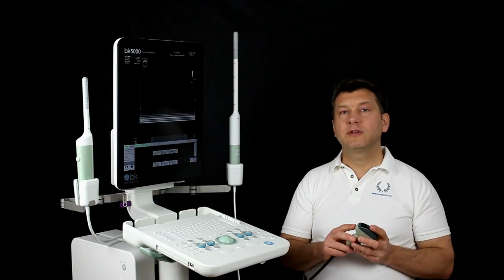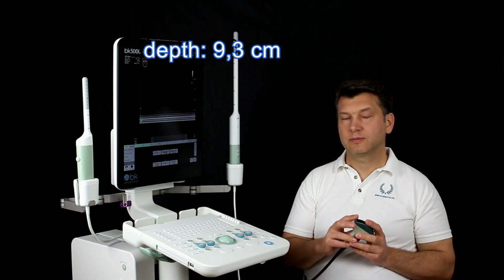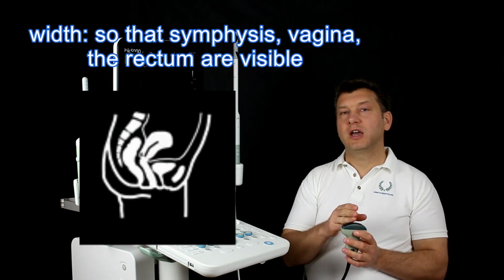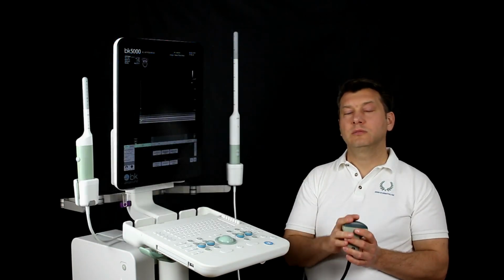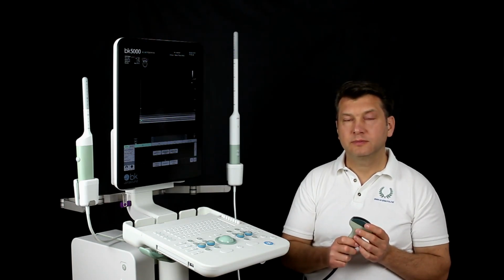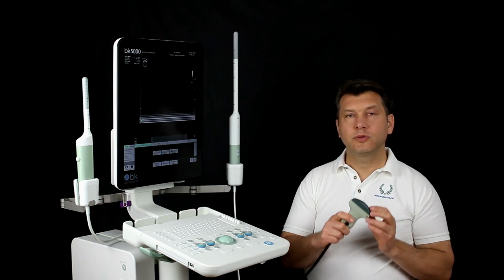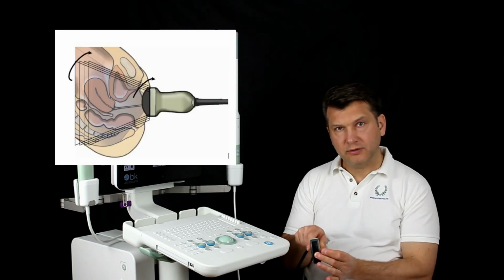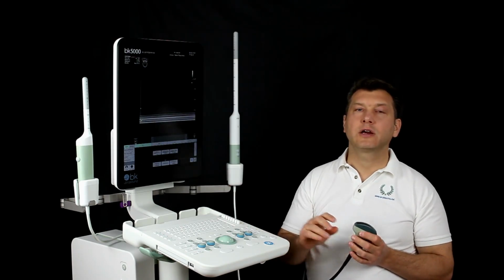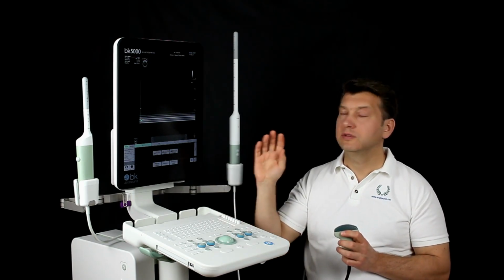Summary. Frequency 6 MHz. Depth 9.3 cm. Width so that symphysis, vagina and the rectum are visible. Distance 0.5 mm. Time 5 seconds. Important: the tilting movement of the examiner's hand. Please note that all these parameters are considered to be your personal preset and can be customized if necessary.